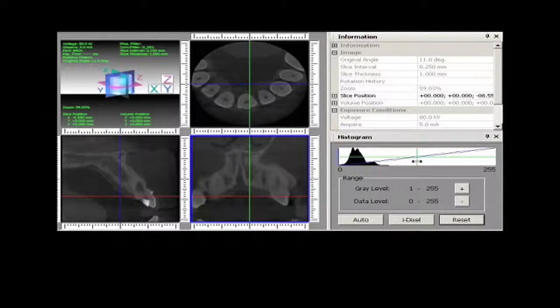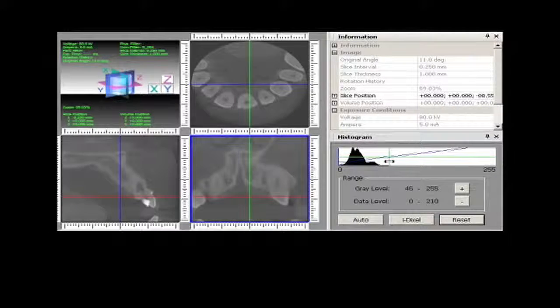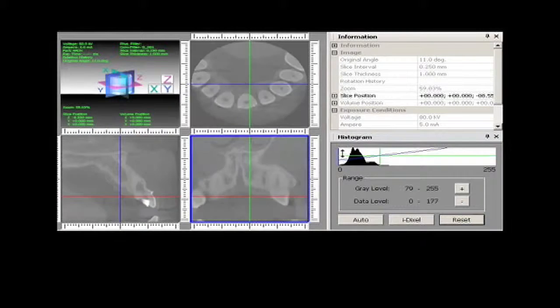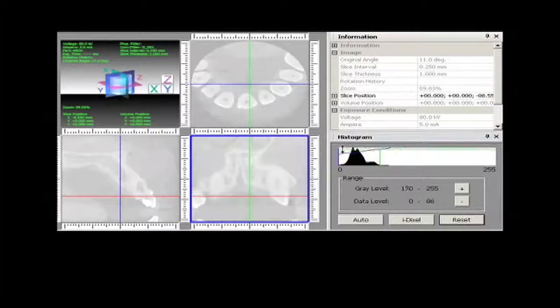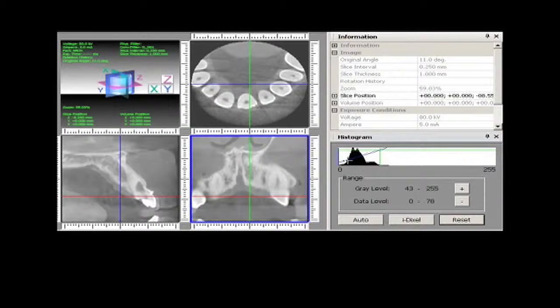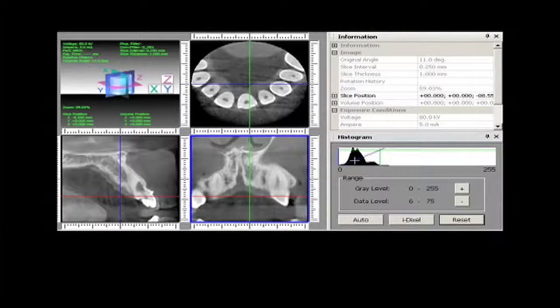The histogram in the lower right box controls the brightness and contrast. Once optimized, the images are dynamic, meaning there are a whole series of them that can be viewed as you travel through any plane.